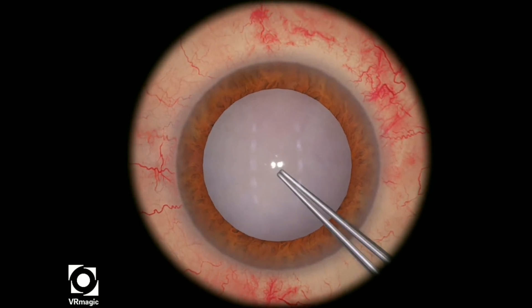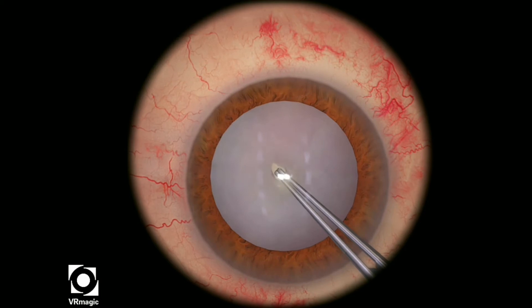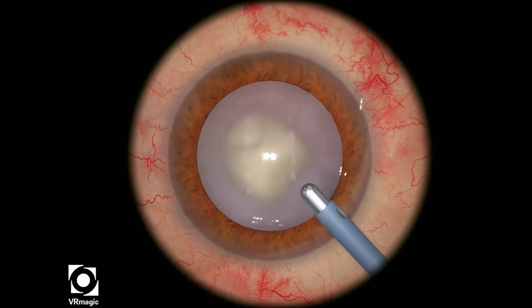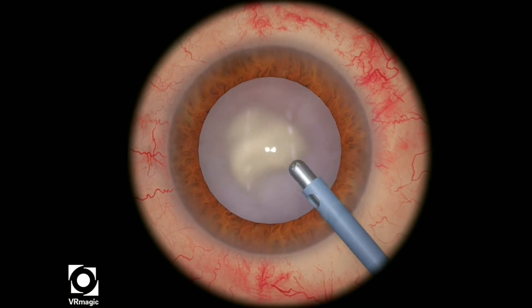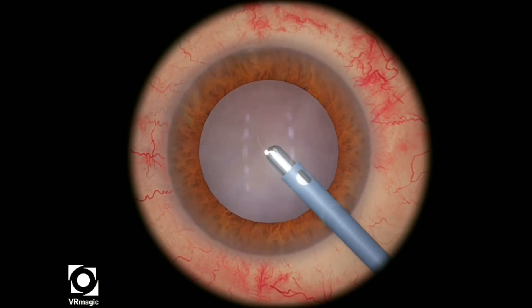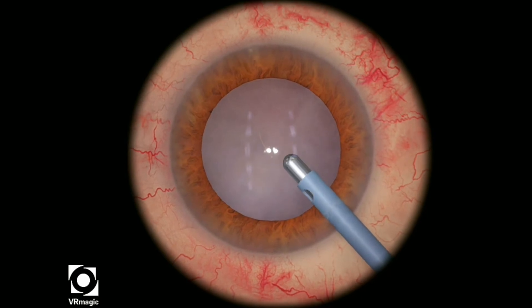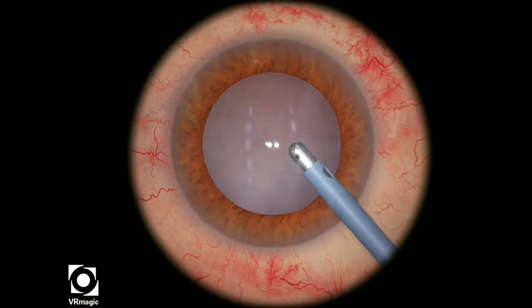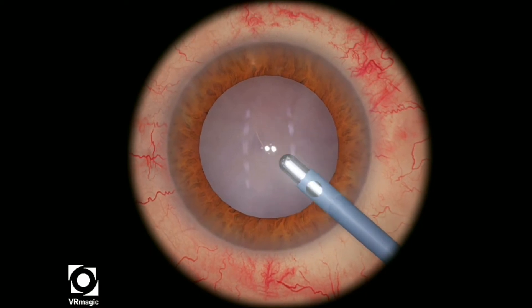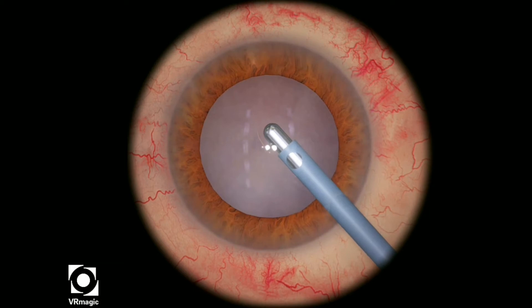Now, in this particular level, when you pierce the center, white milky fluid will come out, and I want you to stop. Get the IA, set it to a relatively low aspiration level, and then make sure that the tip is pointing at the top. You want to try to aspirate very gently the fluid that is coming out of the lens.